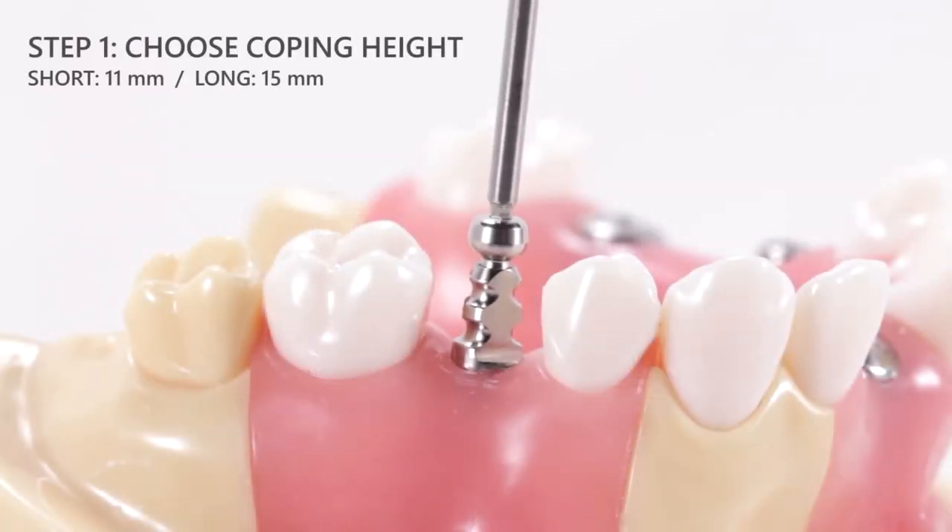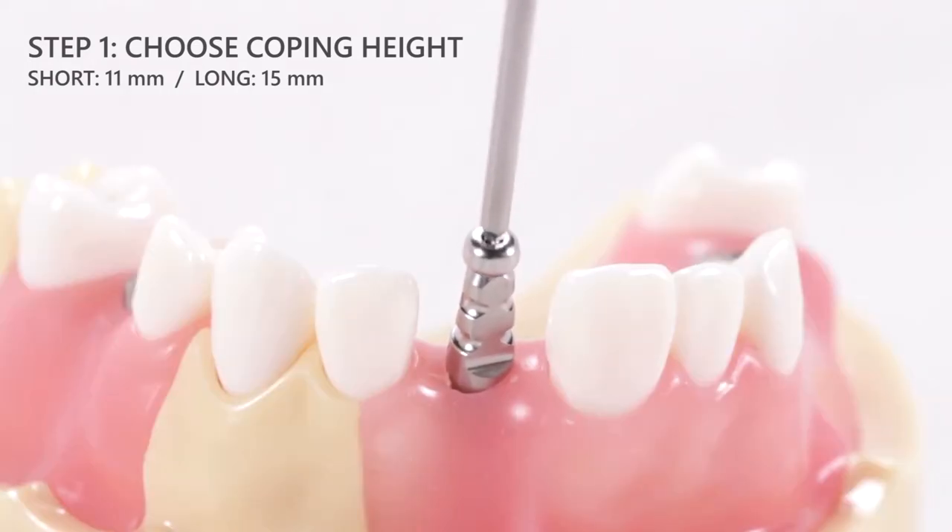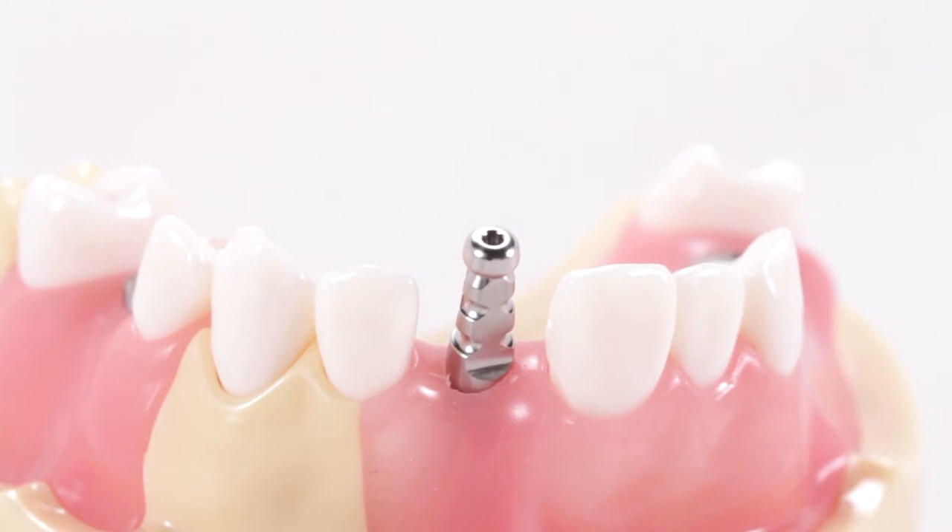A short coping may be more applicable for posterior applications or in patients with limited mouth opening, whereas a long coping may be better for anterior applications or in regions where a taller impression coping is needed to match the cervico-incisal heights of the adjacent teeth.